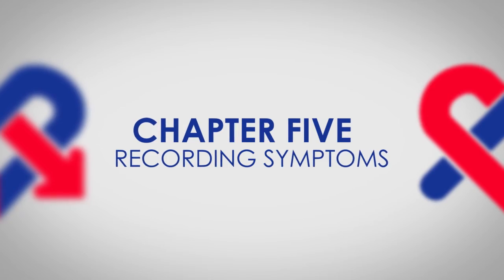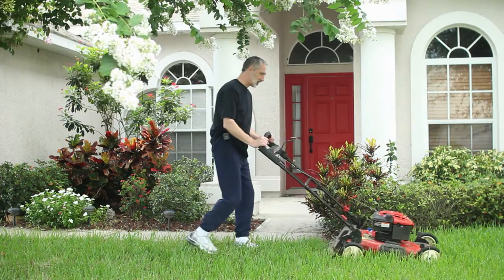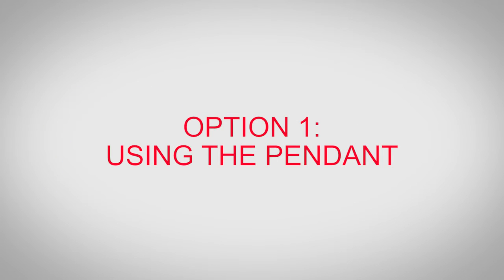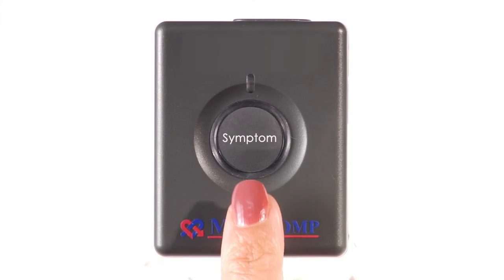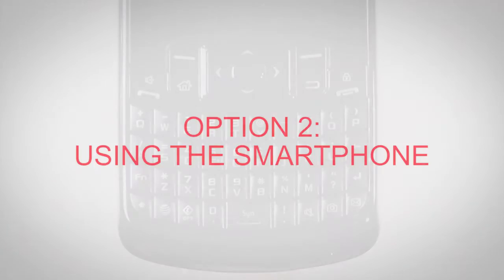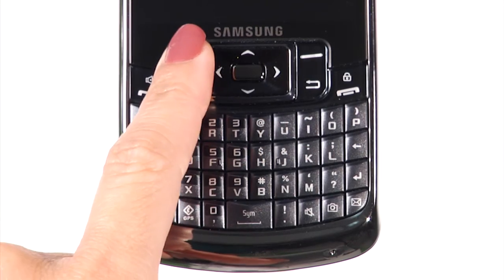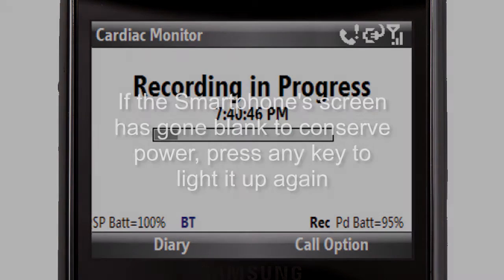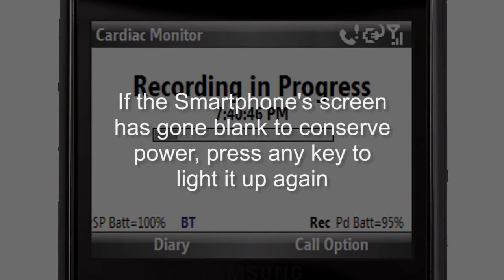Recording and sending your symptoms: Whenever you feel a symptom, press the symptom button on the pendant. There are two options to record a symptom with this monitoring system. Option 1: Using the pendant — press the symptom button on the pendant. Option 2: Using the smartphone — press the left soft key under Record/Send on the smartphone. Either option will initiate recording in progress, and the smartphone's display screen will show a progress bar. If the smartphone screen has gone blank to conserve power, press any key to light it up again.